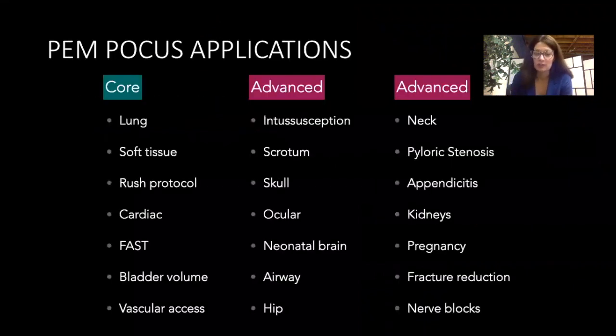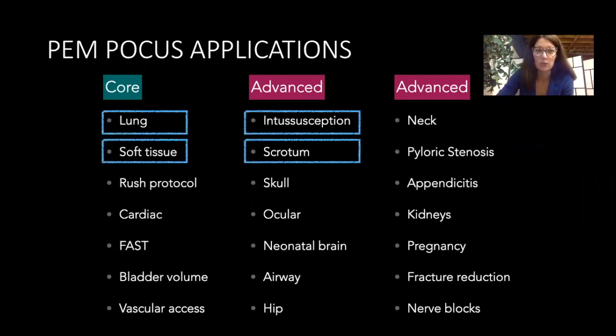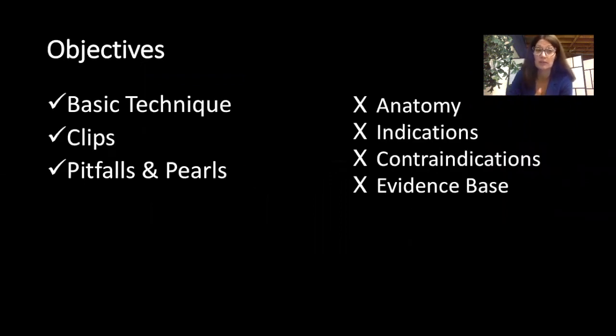So if you saw Dr. Michelle Lee doing POCUS at SickKids, these are all of the different things you may see her scanning. Obviously, we can't cover all of this today, so we've chosen two core applications, lung and soft tissue, and two of the can't miss diagnoses in pediatrics. We'll cover the basic technique, some interesting clips, pitfalls and pearls, but we won't be able to cover anatomy, all of the indications and contraindications, or the evidence base.